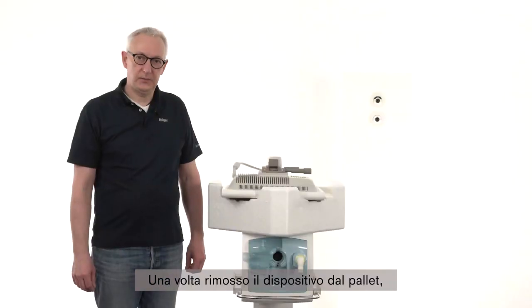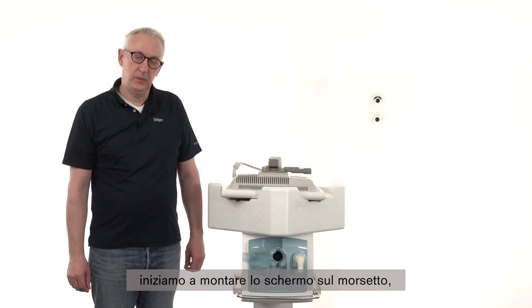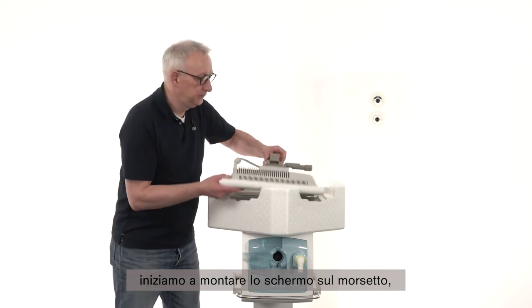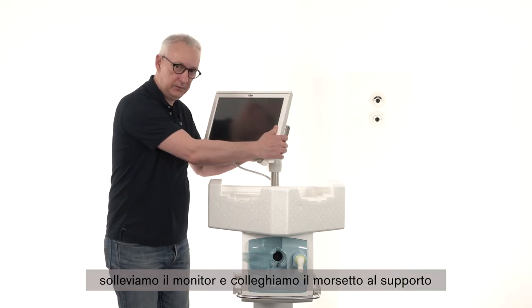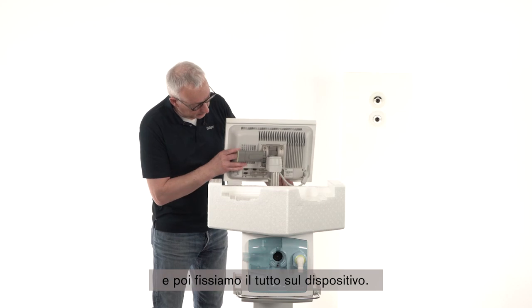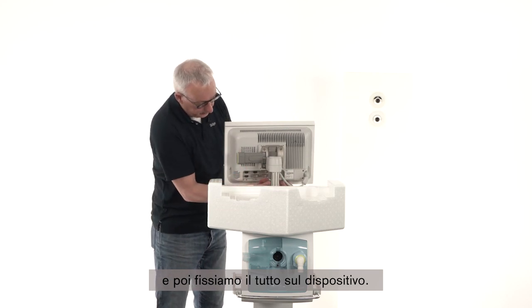After rolling the device up from the pallet, we start to install the screen on the clamp. Lift the monitor and connect the clamp to the holder, and fixate that on the device.